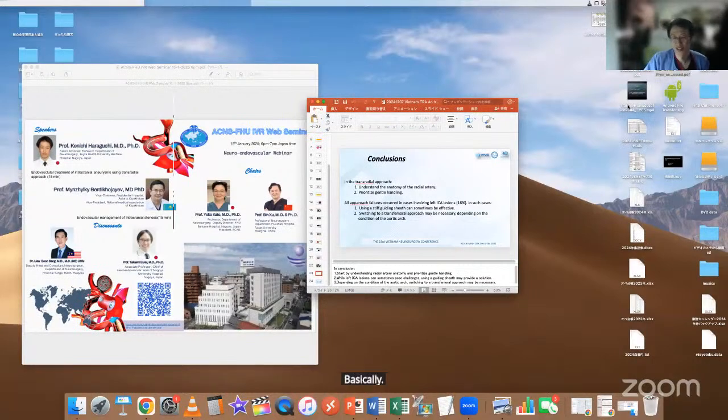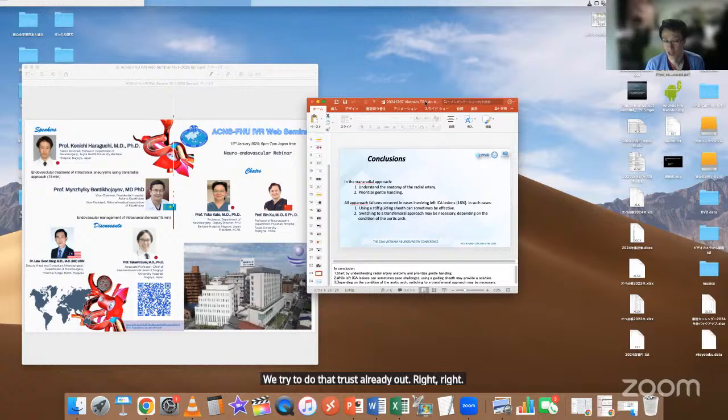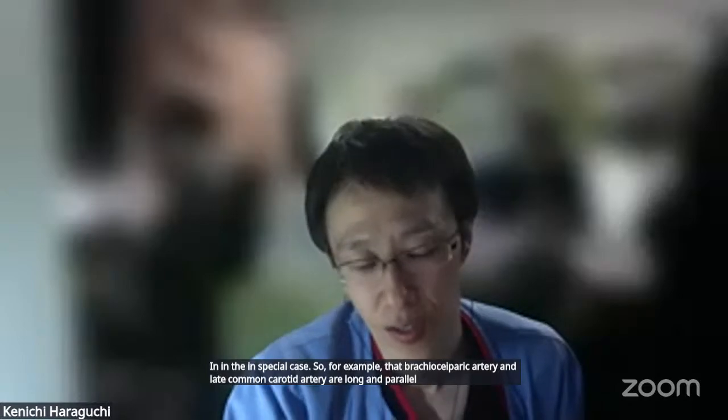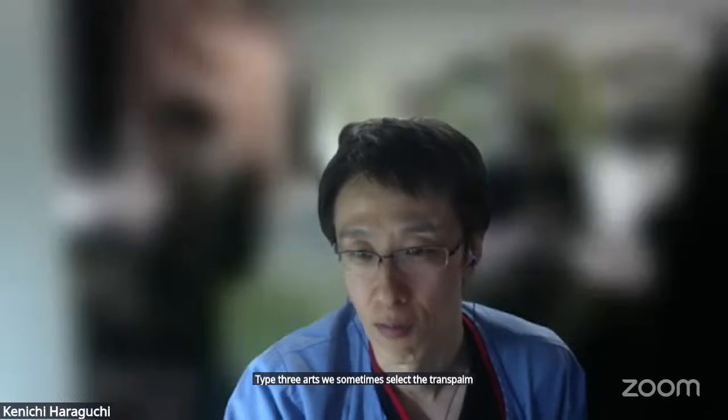Basically, in all cases, we try to do the right transradial approach, but in special cases, for example, when the brachiocephalic artery and left common carotid artery are long and parallel, or the severe type 3 arch, we sometimes select the transfemoral approach from the first time.